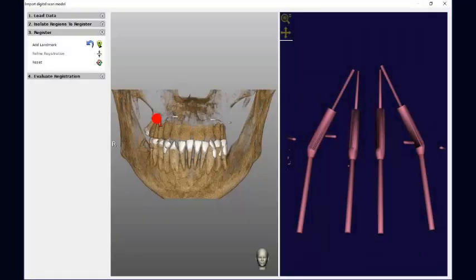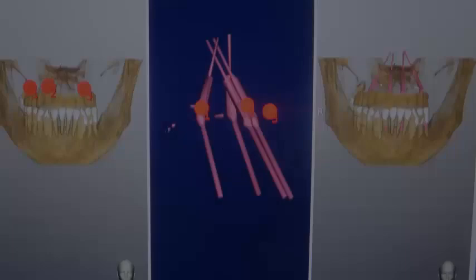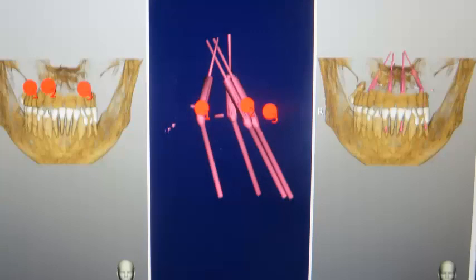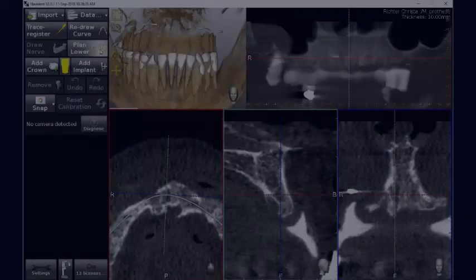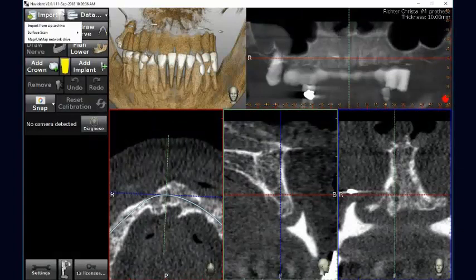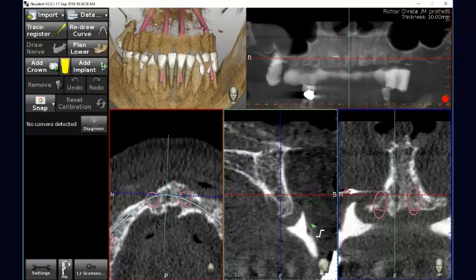We pinpoint specifically the CT markers on both the DICOM and STL data until we reach the third point, and we can also add a fourth point in order to maximize the matching. Once the matching has been carried out, we can save and have it in the Navident data.